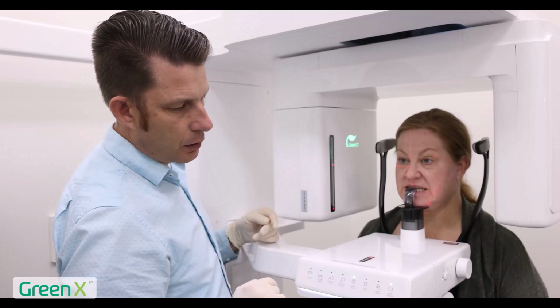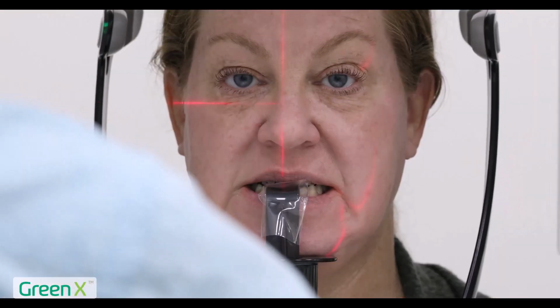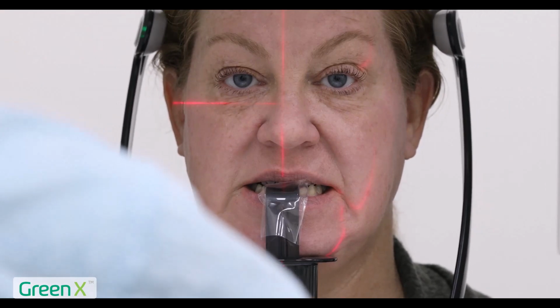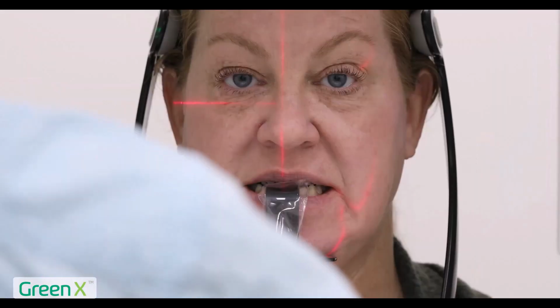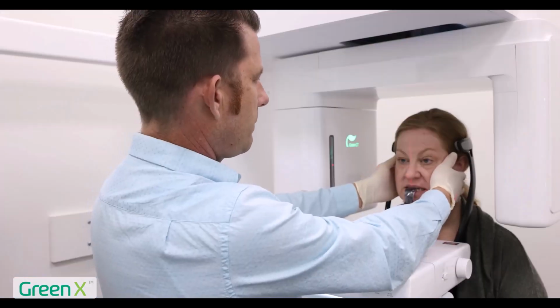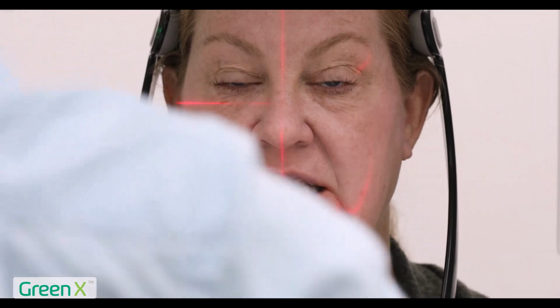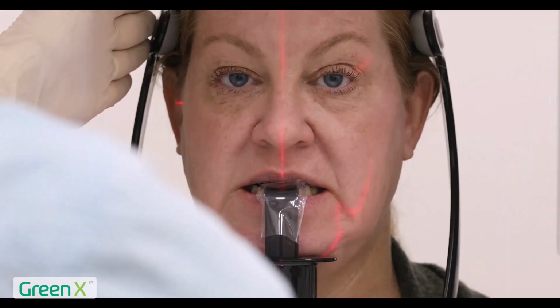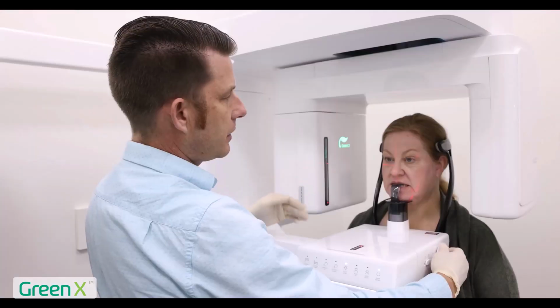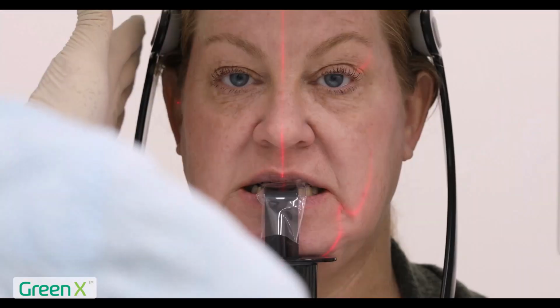Next, I'm going to close my temple supports, and on the green platform, I can just use the wheel on the side of the column here and tighten the patient down. And I want to ensure the patient's lined up. I'm going to twist here so you can see that the patient is back lined up center. On this wheel, right now, the temple supports are just touching the head. I want to actually crank that down so you can see, make sure that that's very firm.